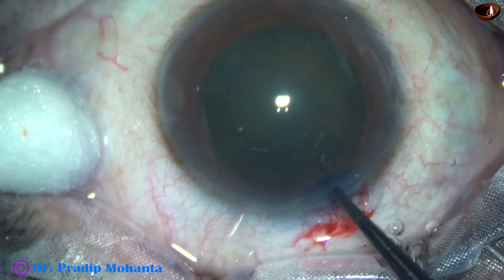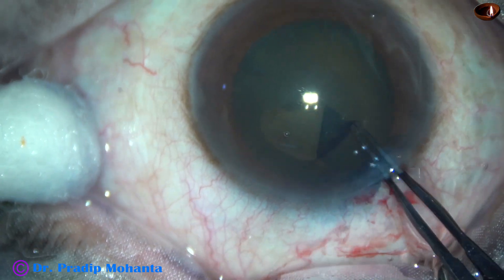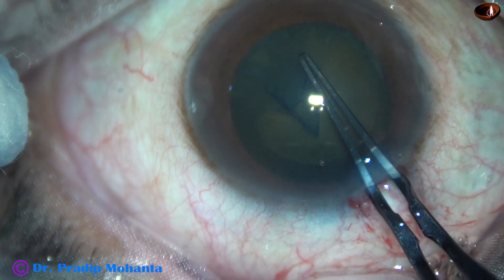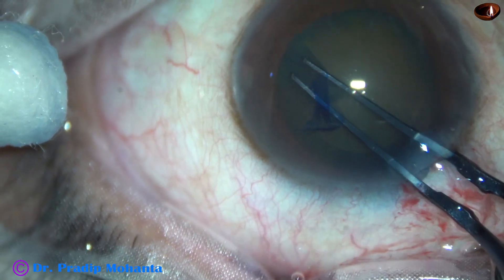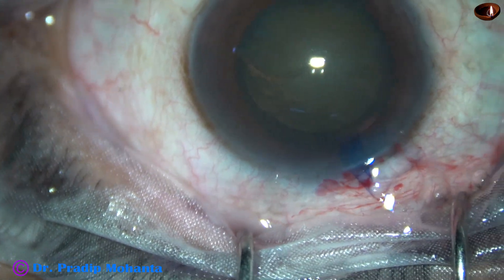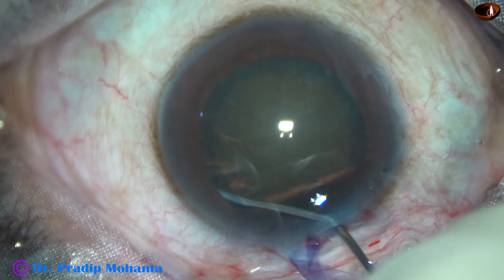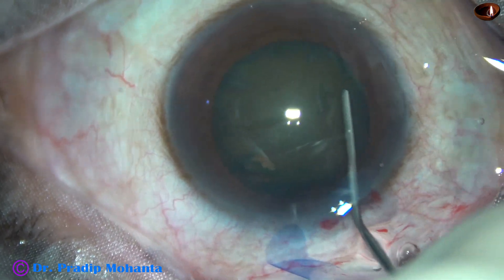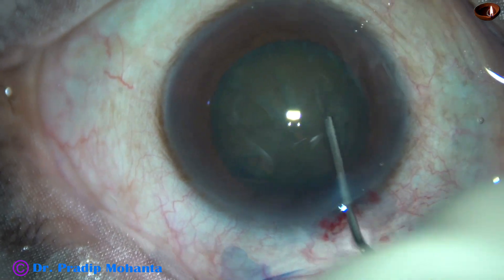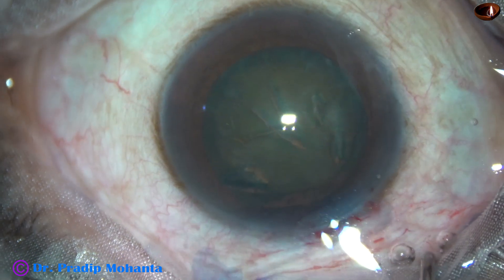Now capsulorhexis with Utrata forceps. Introduce the Utrata, lift the anterior lip of the main wound, incise the anterior capsule with the tip of the Utrata forceps, and raise a capsular tag. Guide this tag to get a rhexis of about 5.5 mm. It is always better to make a rhexis larger than 5 mm and a little less than 6 mm, because the capsular opening will contract over time, so the rhexis should be a little larger than 5 mm.